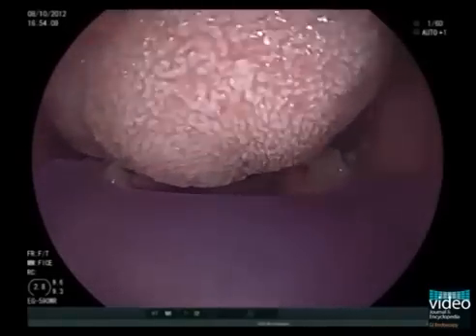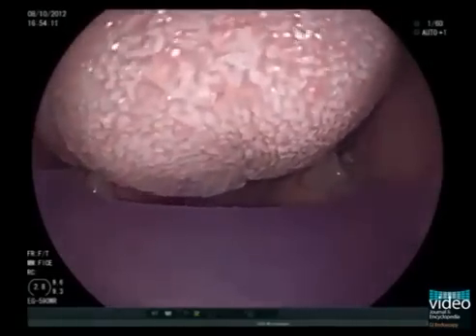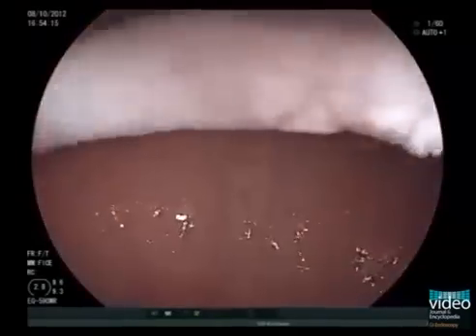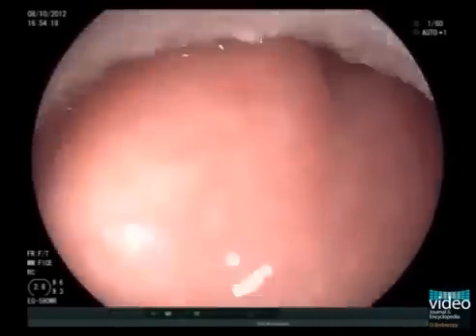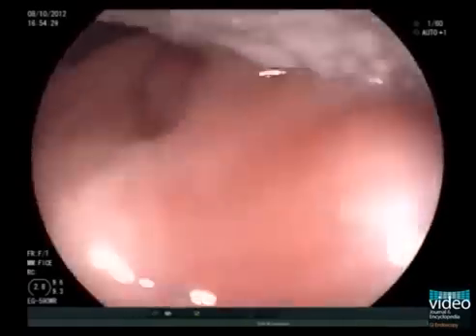Now we will perform upper endoscopy in a 62-year-old male patient with epigastric pain. First, put the tip of the endoscope on the patient's tongue. Under direct vision, guide the scope through the mouth. You can see the uvula at the 6 o'clock position.